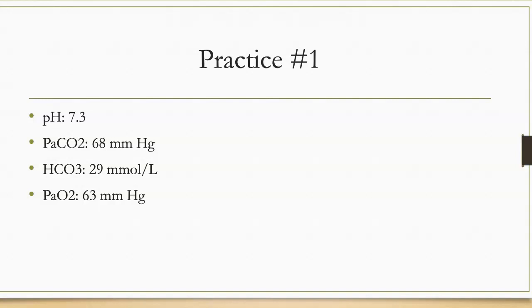So for the pH, can we talk about that? That's going to be acidotic. The CO2 is also acidotic, as well as the bicarb is alkalotic. So if we were going to interpret this gas, we would interpret it as partially compensated respiratory acidosis.